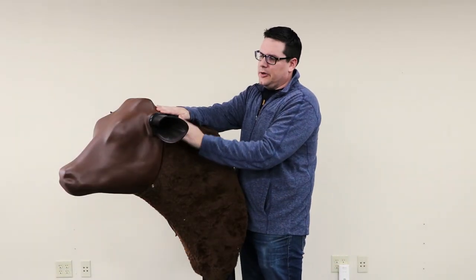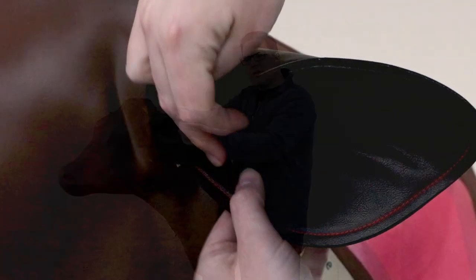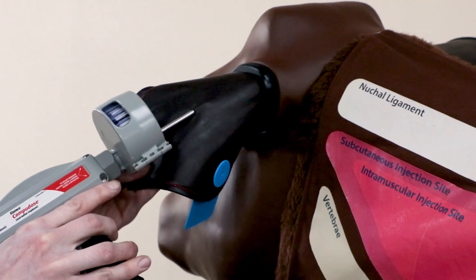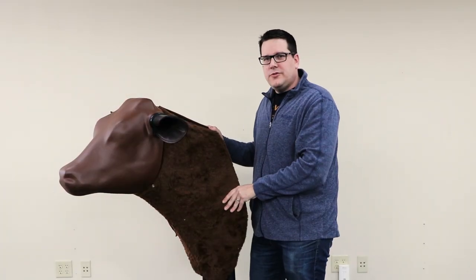The other part of the animal has removable ears that allow you to do actual implants and also ear tagging. You can do that multiple times to get the understanding of both sides of the ear as well. Those are the main features of the bovine injection simulator.